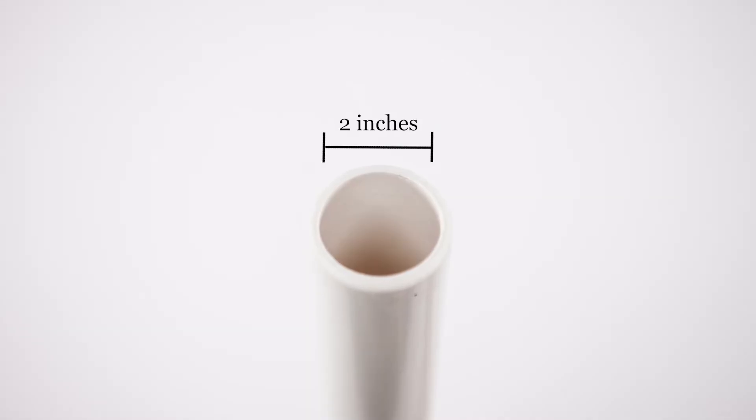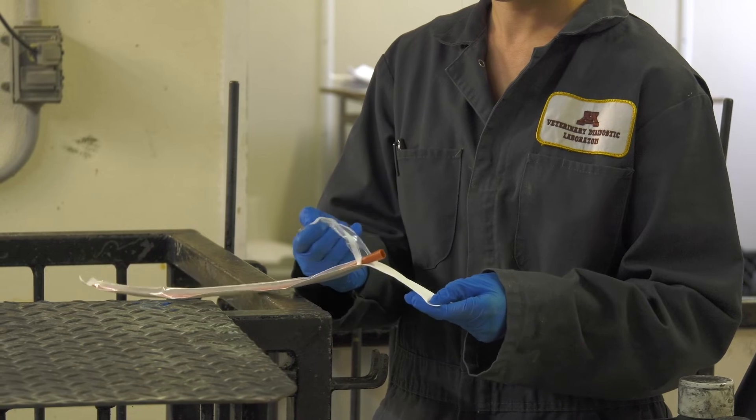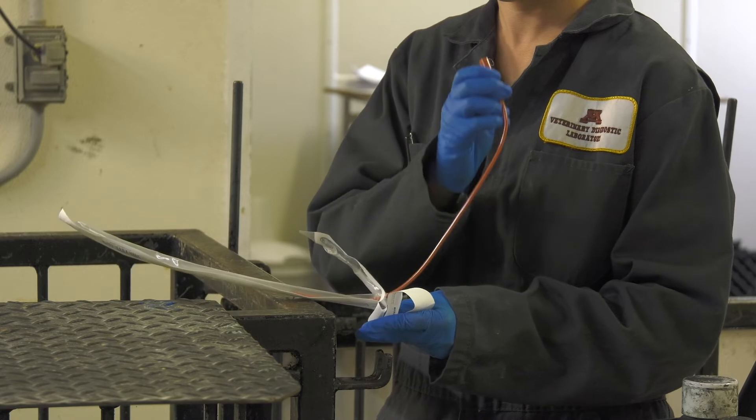Another alternative to a mouth gag and tongue depressor could be a piece of 2-inch or 5-centimeter PVC pipe, or 1-inch or 2.5-centimeter pipe for piglets. Make sure the edges are sanded smooth. Remove the catheter from packaging. If you don't have a sampling catheter, an artificial insemination catheter will work fine.